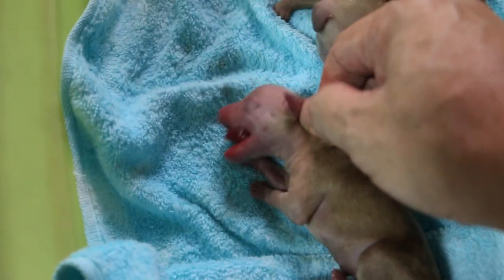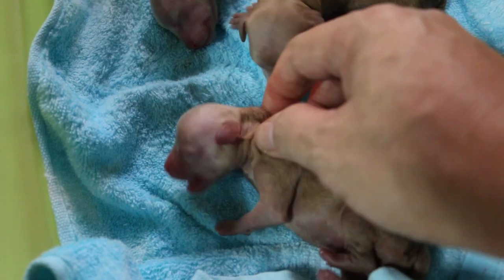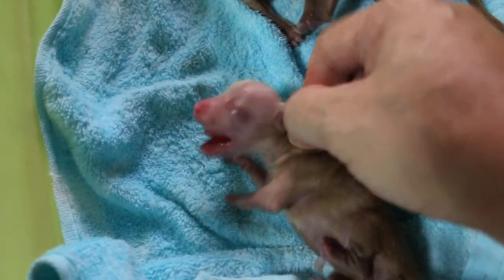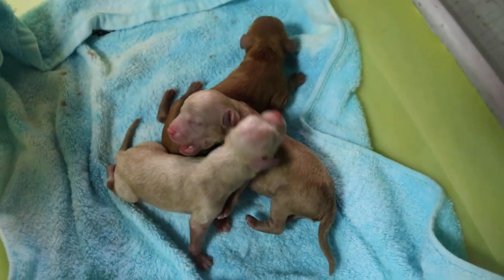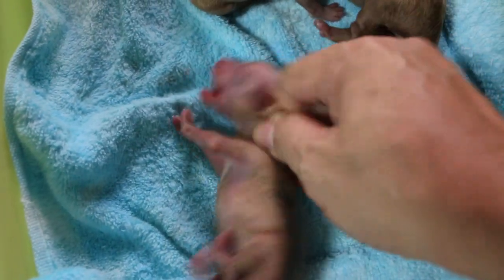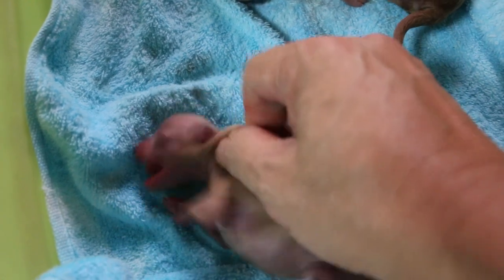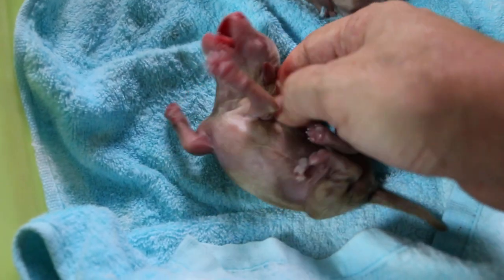The tip is to open up and take out the whole uterus with the horn — left and right. In this case, these three were the ones taken out, and this is the fourth one, the hidden one, on the left, far up near the ovary.